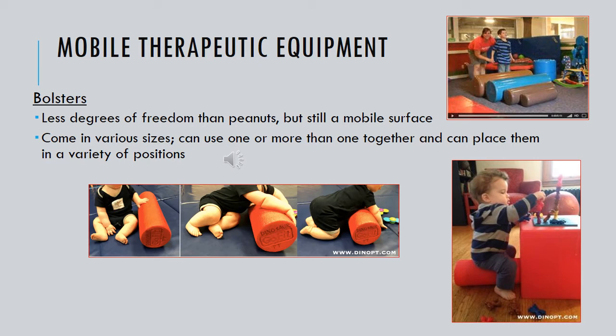It's important to note that if you're using a bolster for sitting, that you want to make sure that your patient has an appropriate and adequate amount of weight bearing so that they're actually sitting on their IT. So you want to pick a bolster that's large enough to afford the patient this opportunity, but not too large that it's overstretching them or putting them in poor alignment.